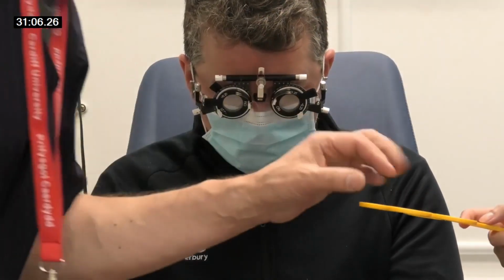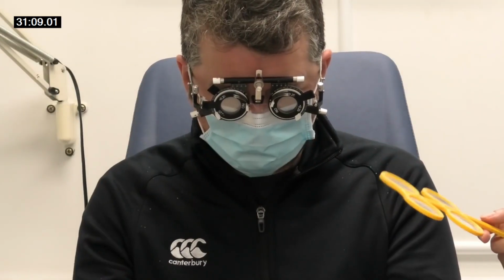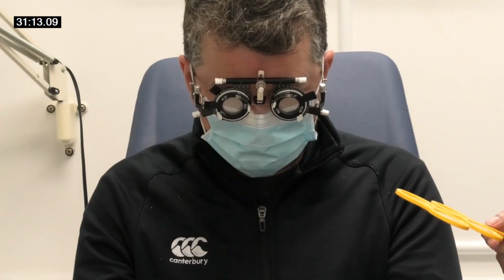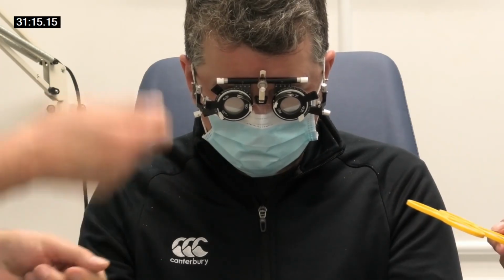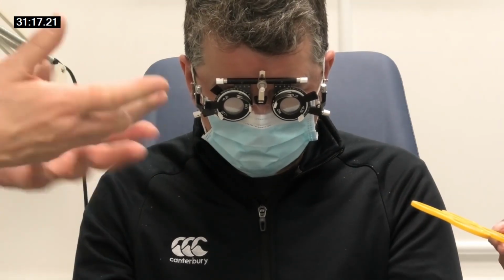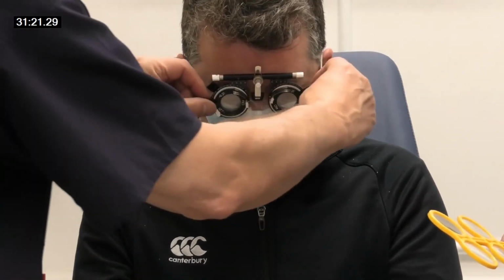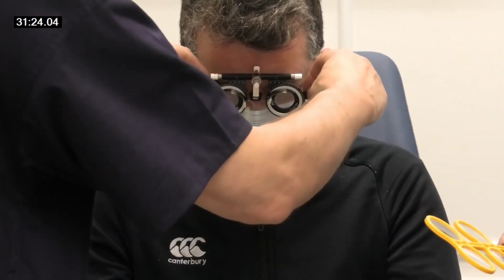So because that's minus, isn't it? Yeah. So when they say it's about the same, I never really give them an out. Yeah. Okay. Because obviously that's not really helping that much, is it? The thing with this age, if we put plus in, they'll always say, "Oh yeah, that's better, that's better, that's better." Yeah. But really, he's sort of on the cusp of needing something on for close, really, isn't he? I mean, that's his normal eyes.